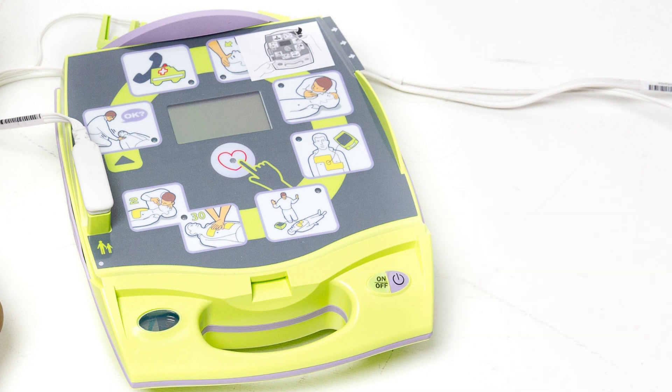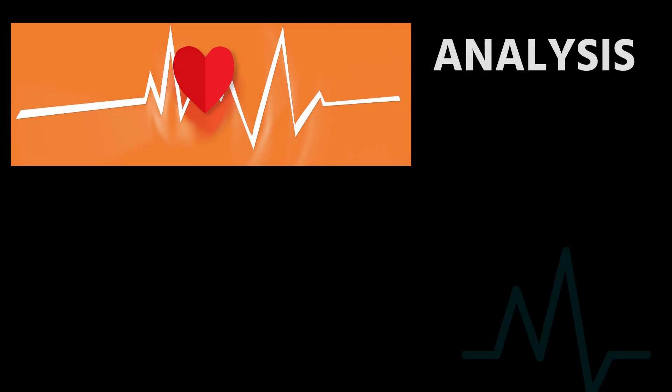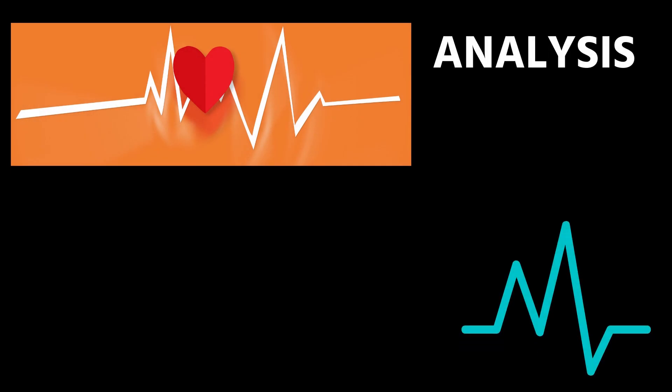You have opened the case and pressed the power button. According to the simple audio and visual prompts on the AED, position the pads on the victim according to standard procedures. It doesn't hurt to know these positions prior to this.